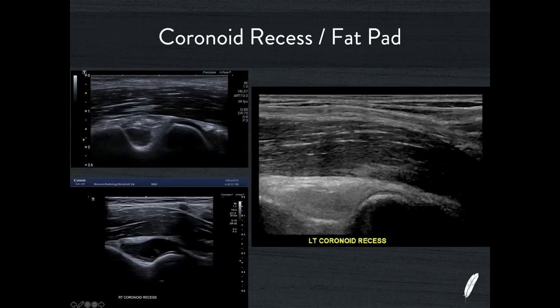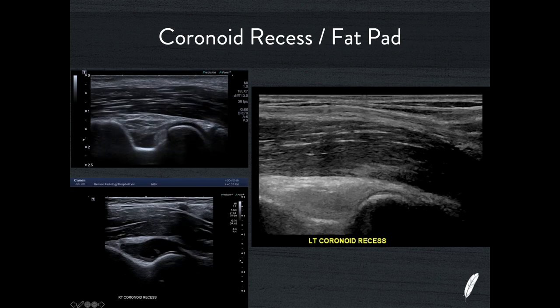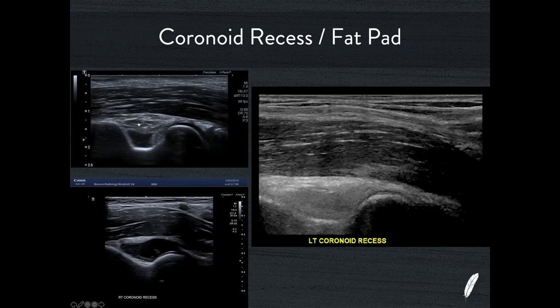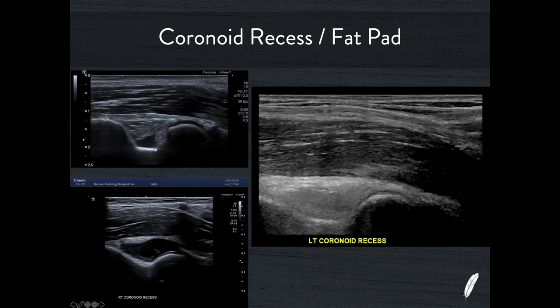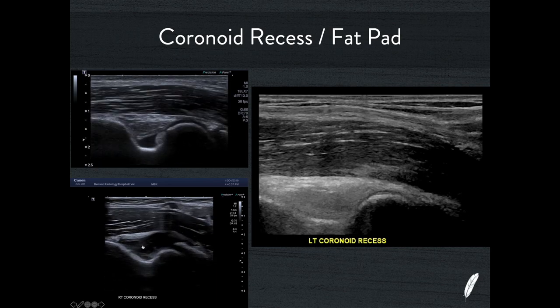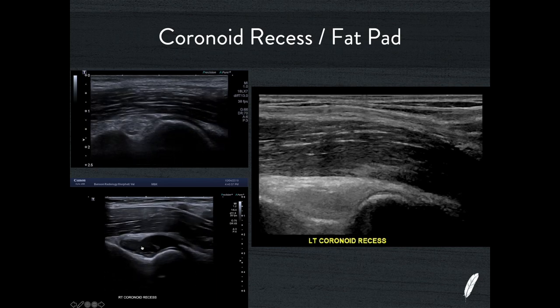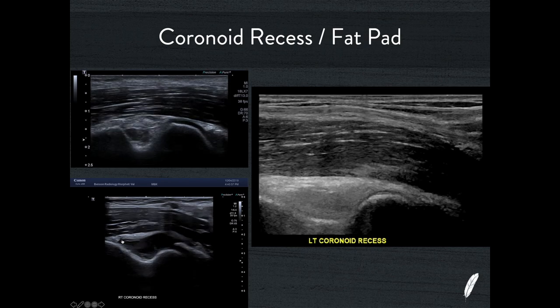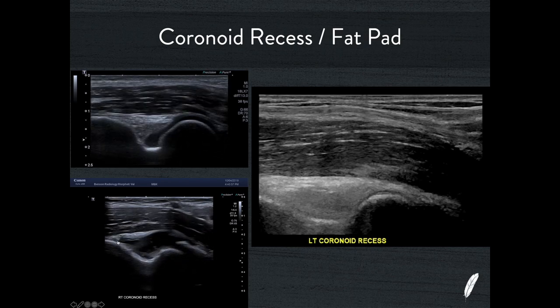With the elbow I start with the coronoid recess, which is just on the medial side of the distal humerus. You can see there is a small amount of physiological fluid here on this video, then this is the brachialis muscle in front of it and this is the anterior fat pad — extra-articular, sitting just on the surface of the joint capsule. This is a normal physiological amount of fluid. If you contrast that to this patient, there's now a larger pathological joint effusion and that extra-articular fat pad has been displaced anteriorly and superiorly, causing the sonographic version of the anterior sail sign from a lateral radiograph of the elbow.